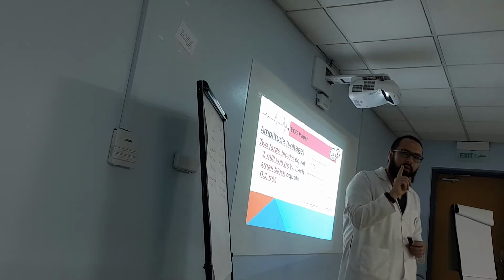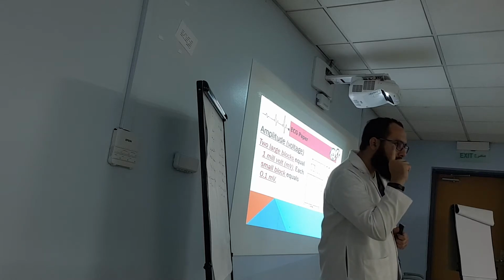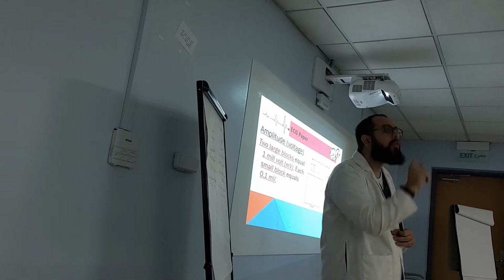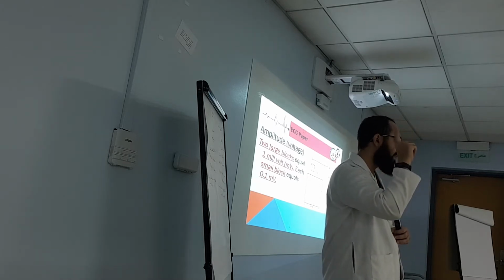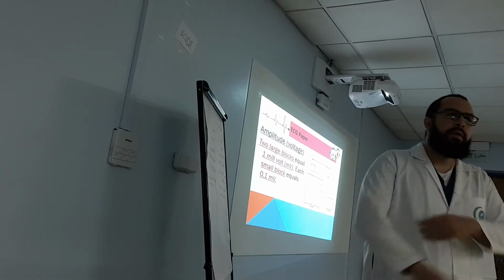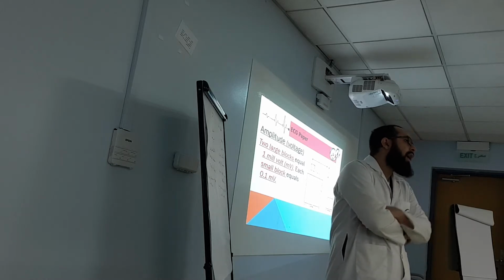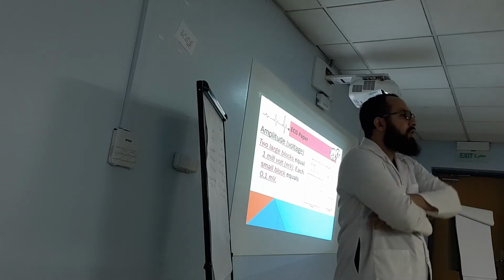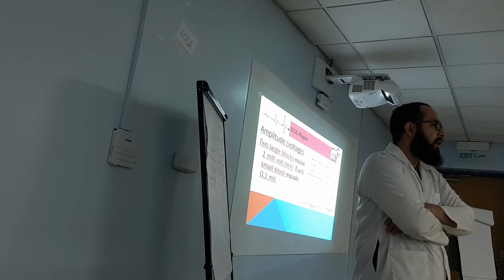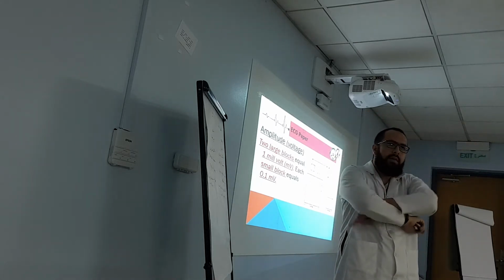0.1. Okay? You get it? So 1 small square equals 0.1. How many small squares equal 1? 10. Anybody have a different number?